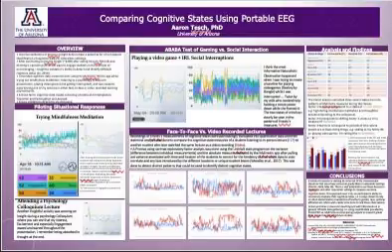And in the end, the thing that I really got from this experiment was that it is indeed possible to use these relatively cheap and portable EEG devices to get objective data on how students are responding to lectures, and using these devices in more naturalistic settings, it would be possible to get meaningful data.